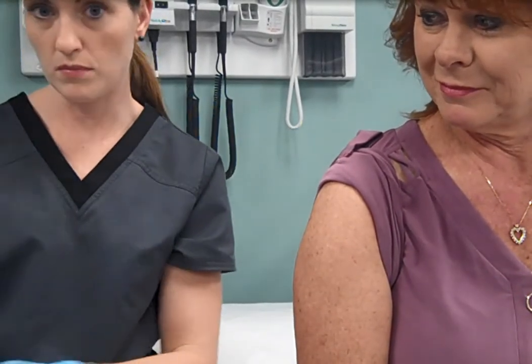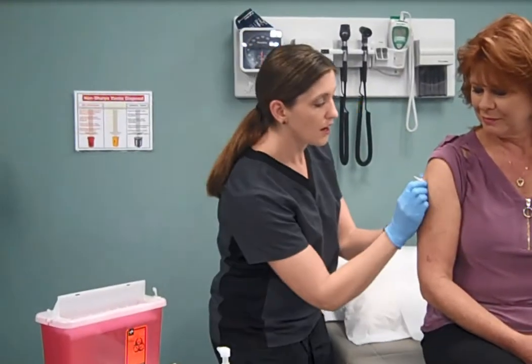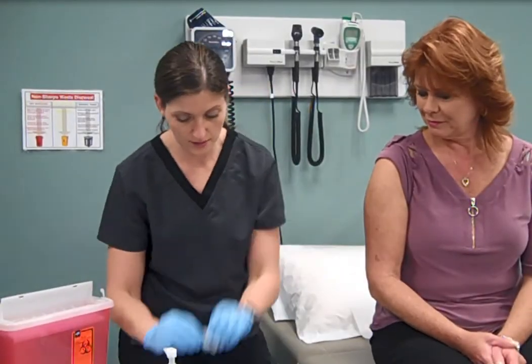Remove the needle quickly by the same angle of injection. Apply the safety and discard into the sharps. Wipe the site gently and make sure your patient is okay.